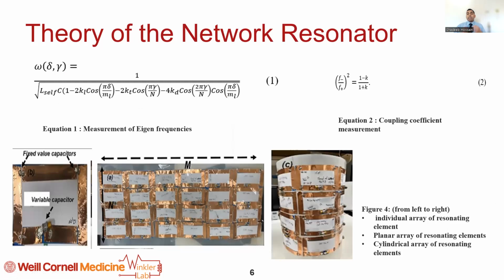Now, the thing is, as an engineer, it is very important to mathematically calculate these values of the coupling, as well as the generated eigenfrequencies. The coupling coefficients are actually calculated from this equation that you will see over here, and the generated eigenfrequencies for different modes are calculated theoretically using this equation.